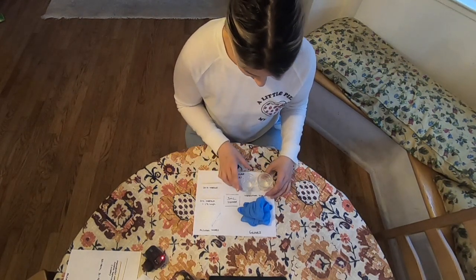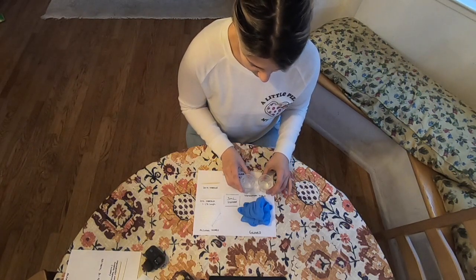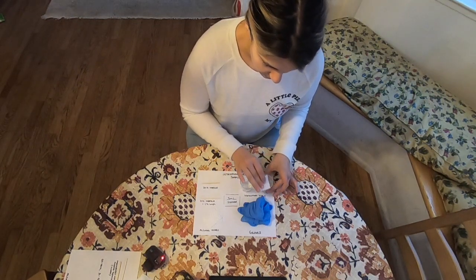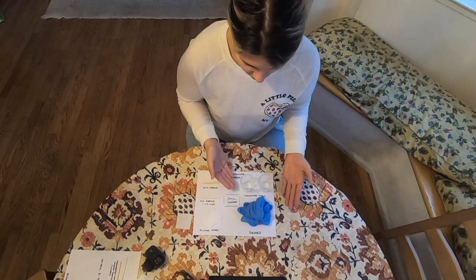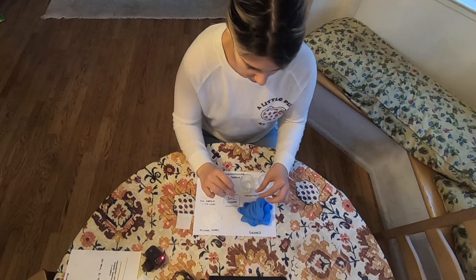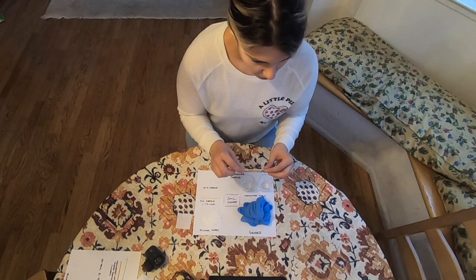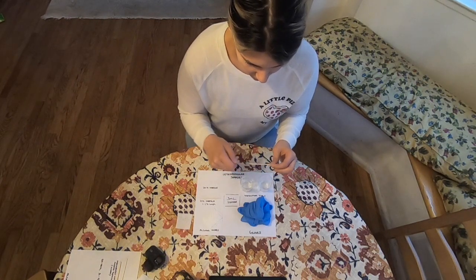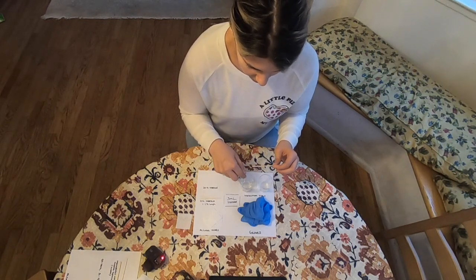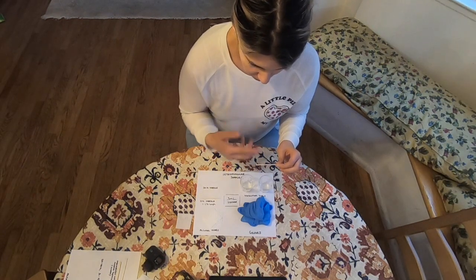When preparing medications in vials, just like previously, clean the tops with alcohol wipes and let them air dry. While those are drying, attach the 20 gauge needle to the syringe. We will then aspirate the amount of air equal to the volume of liquid medication we want to transfer into the powder to reconstitute it.